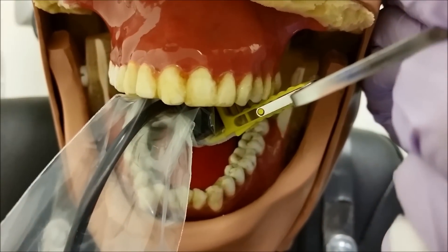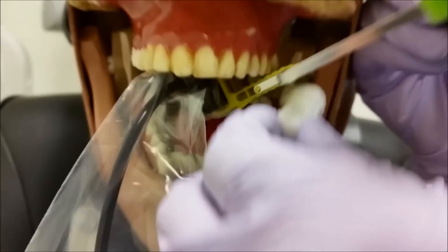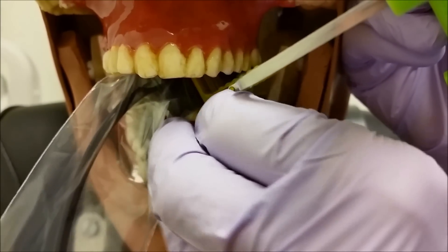To ensure that the bite block is flat on the occlusal plane, the cotton roll will help underneath the bite block.